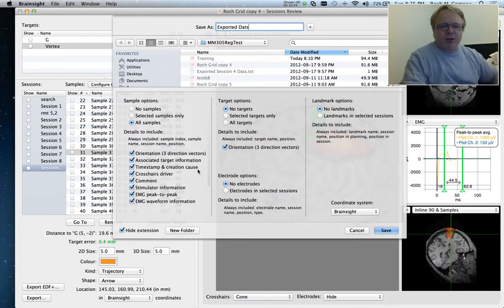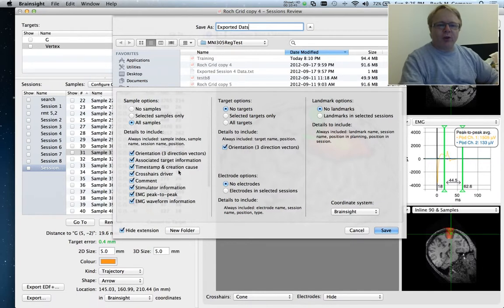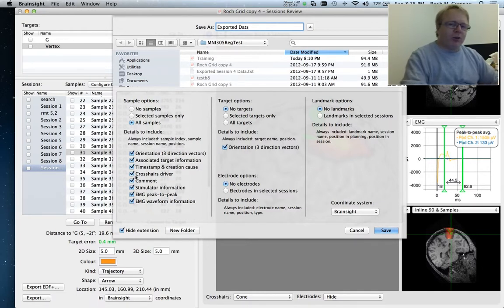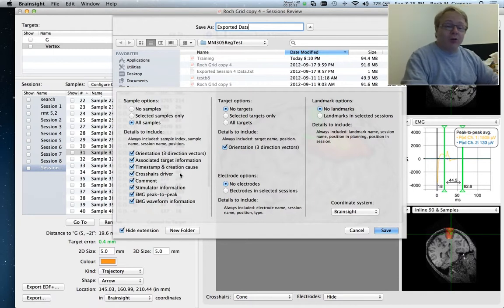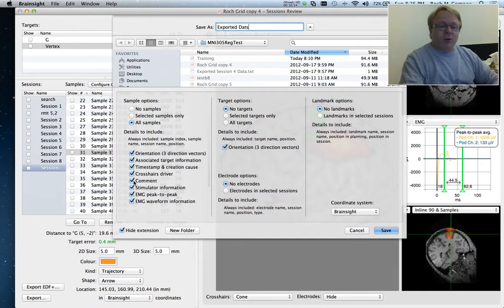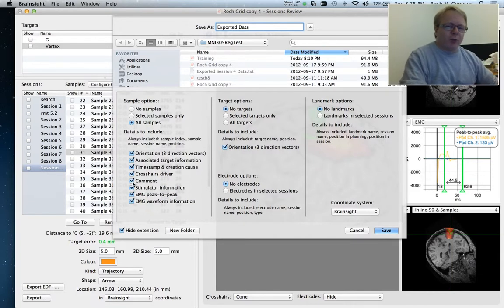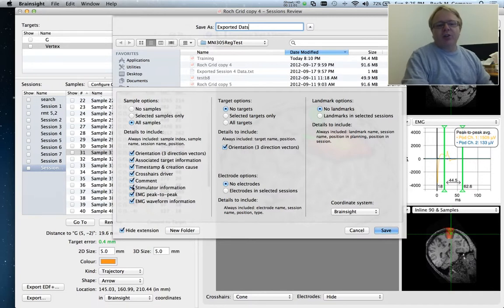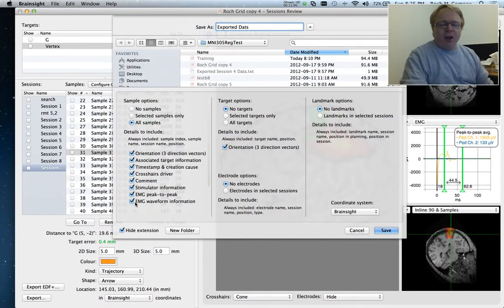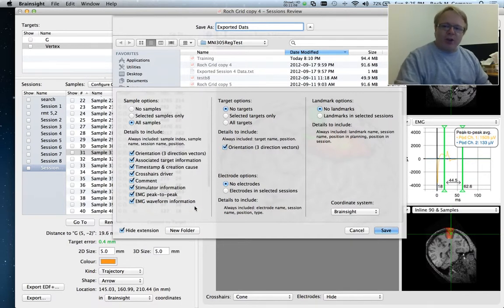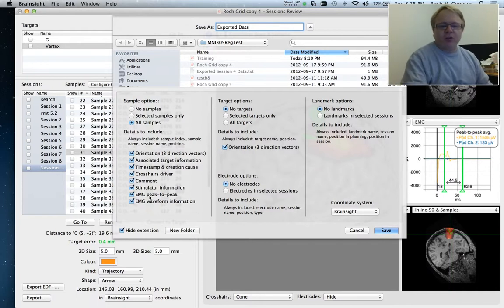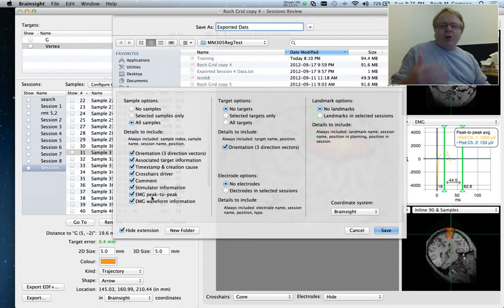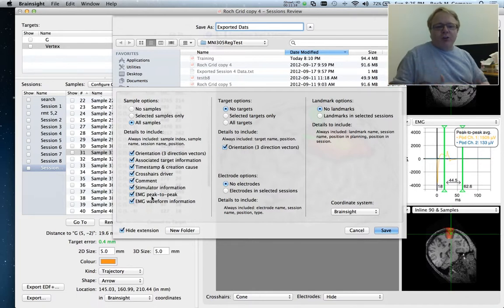We can also export the name of the associated target. The timestamp, so the exact time that that sample was created. Who was driving the system. So if you have one or more coils that are being tracked, then we know which coil was the one that was recorded. You can type in a comment during the TMS session and export that. You can also, if you have the MagVenture or the Bison connected, we can export the stimulator power. As well as the EMG peak to peak. And you can also choose the EMG waveforms. So the actual waveform data can be exported as one of the items in the text file.